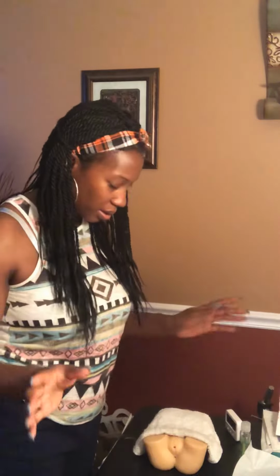Open my kit. Okay. Everything's open. Let me get my checkoff. This is the checkoff that my evaluator will be referring to, to make sure that I do all the steps. She'll check whether I passed or failed.